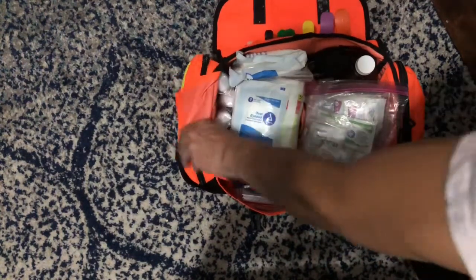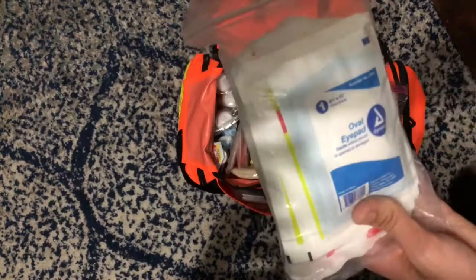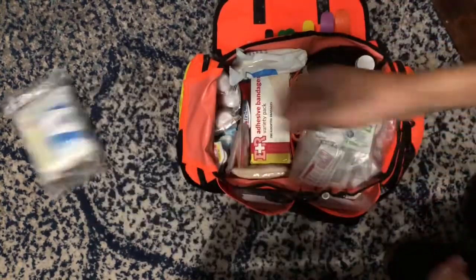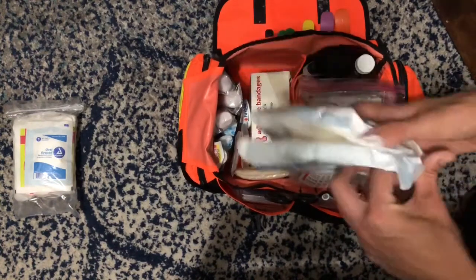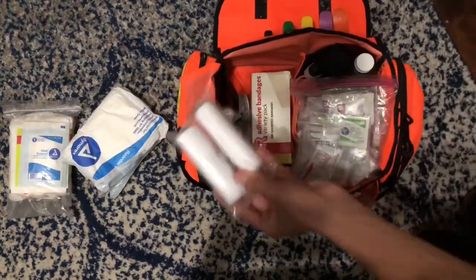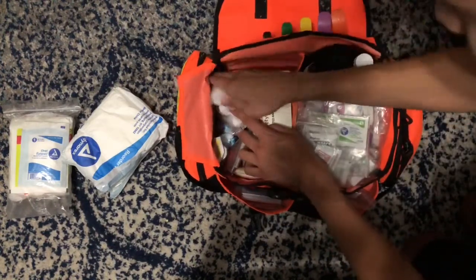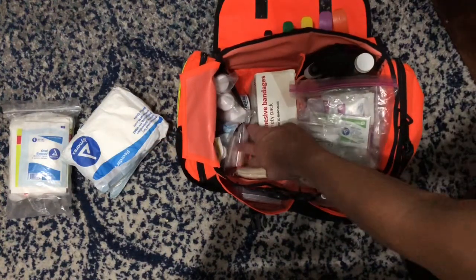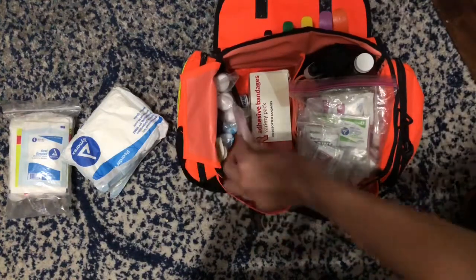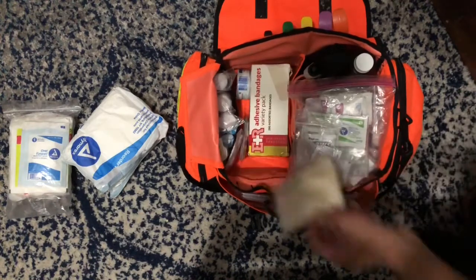And then this section is just mainly for bleeding and has band-aids in it too. Gauze pads, they're organized in sides, then some tape in it. All just filled with gauzes. I have band-aids in here. I have multi-trauma dressing. I have tons of gauze rolls. They come in different sizes. I added some of these on. So I added some of the gauze pads on, and that came with it. Band-aids, some more band-aids. I think these came with it. I added on tape, and the triangle bandage came with it.